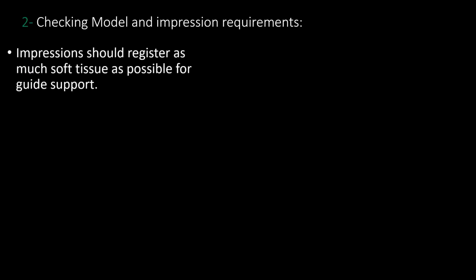Number one, impressions should register as much soft tissue as possible for guide support. Surgical guides do not only rest on teeth. Remember, they sit on teeth and tissue.